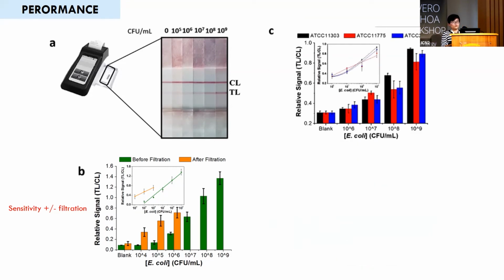We also wanted to prove the universality of this biosensor. We tried different kinds of E. coli species, and finally proved that all of them can reach a limit of detection of 10^6 CFU per milliliter, but this is without the filtration.